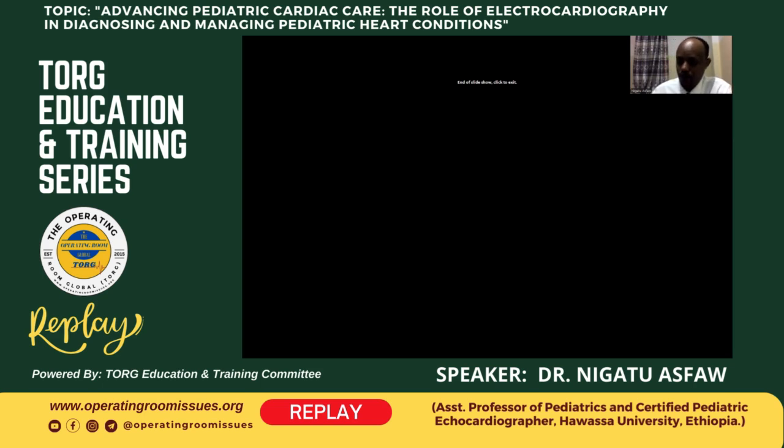Okay, thank you. It may help us, but it is difficult to say. It can help us at reaching a conclusive diagnosis, particularly if there is extreme axis deviation, this is northwest axis deviation, it indicates AV atrioventricular septal defect, or there may be primum type of atrial septal defect.